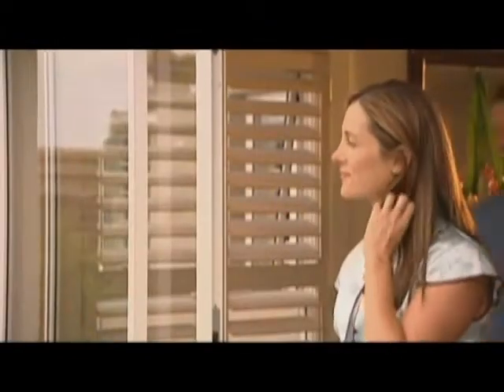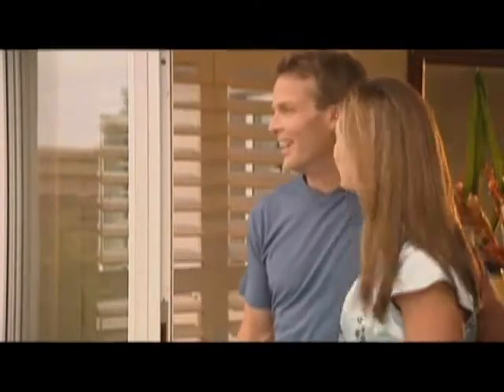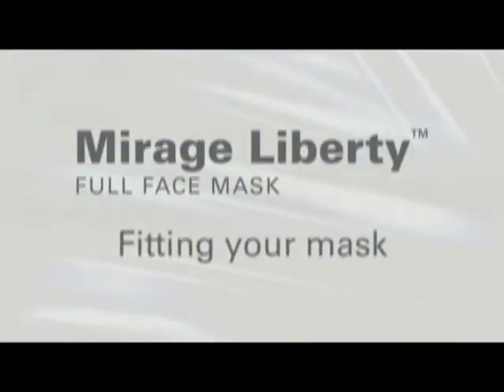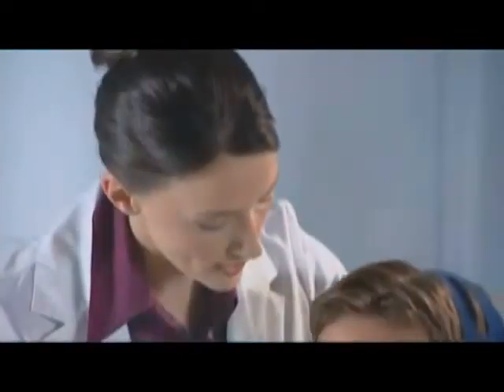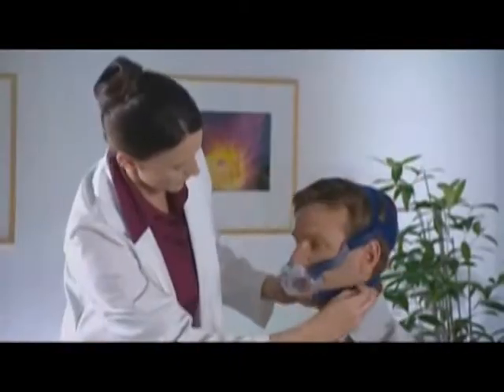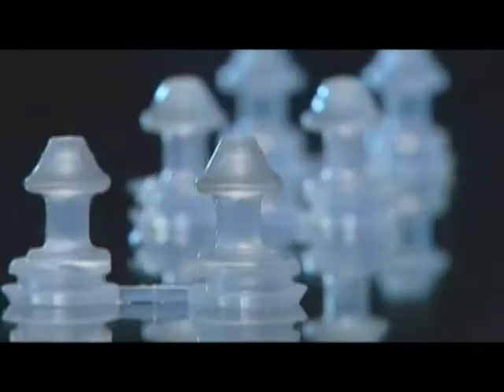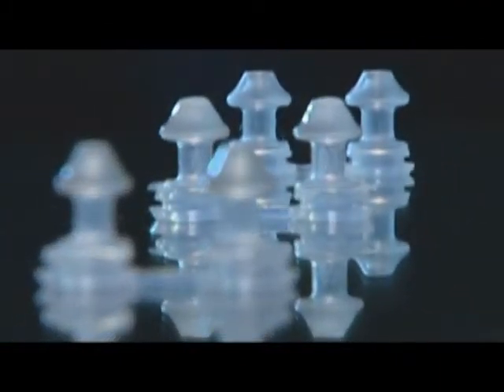The Mirage Liberty sets a new standard of freedom for full face masks, helping you to live life to the fullest. The Mirage Liberty Full Face Mask is designed for quick and easy fitting. Choose the nasal pillows that are the right size for you: small, medium, or large.